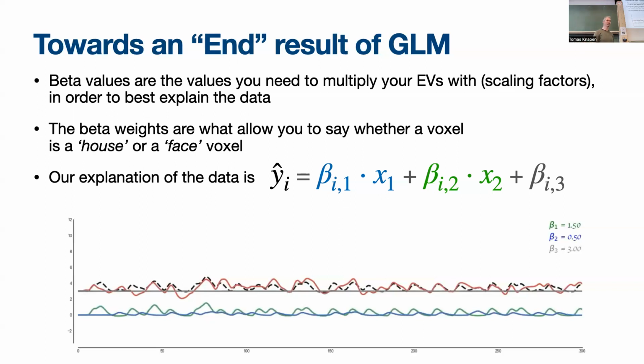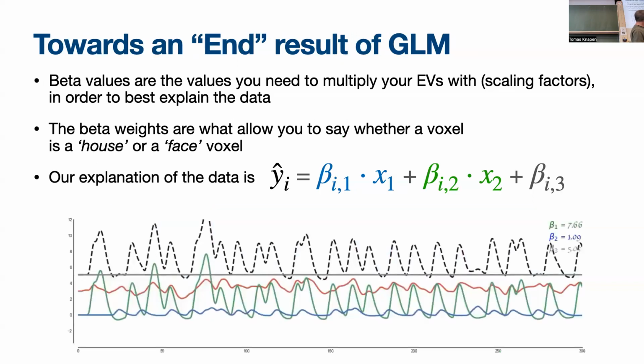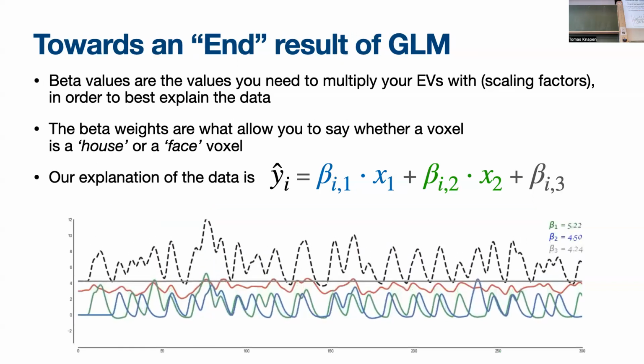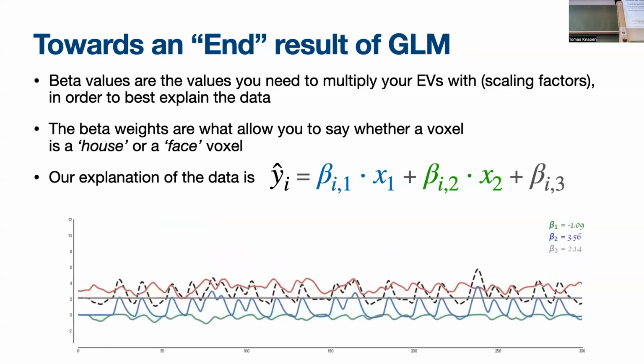So the modeling part, we're going to do it at a voxel level, I think. But it kind of depends on what you call the modeling part. Constructing the regressors, for example, is done before. Only when you want to compare your expectations, right? So these standardized ones, the ones that I just created, they're the same height.